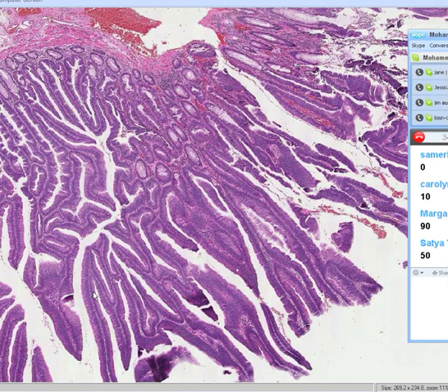That's why it's called a villus adenoma, because the growth is arranged like a finger, like a papillary projection, rather than a tubular structure. That's a villus growth pattern. So if you were to theorize that a villus growth pattern of a mucosal adenoma is a lot more associated with cancer than a tubular growth pattern, you would be damn right.